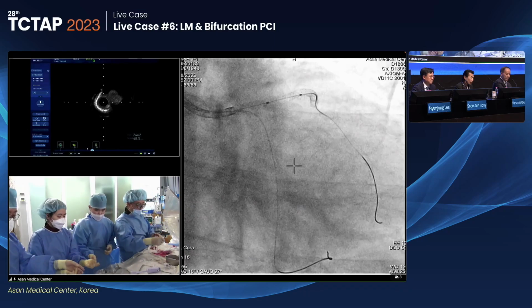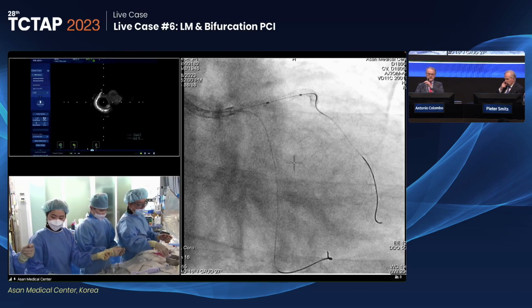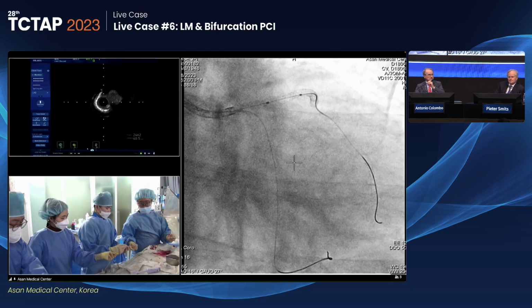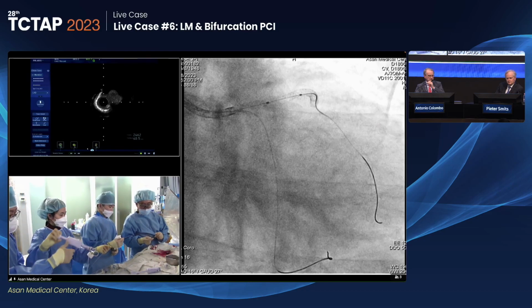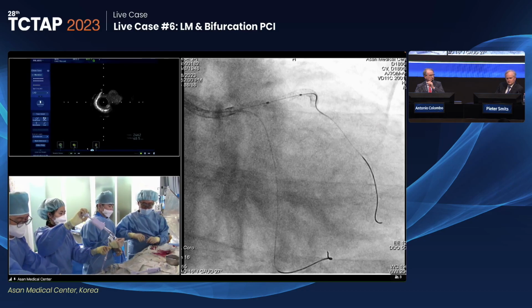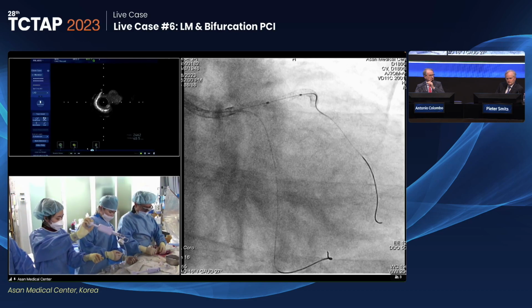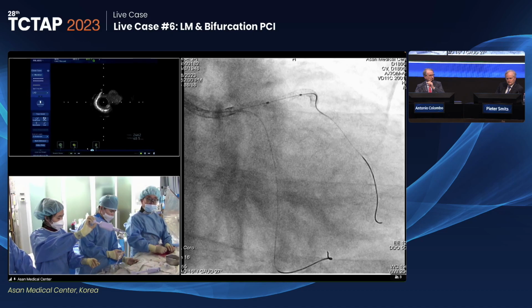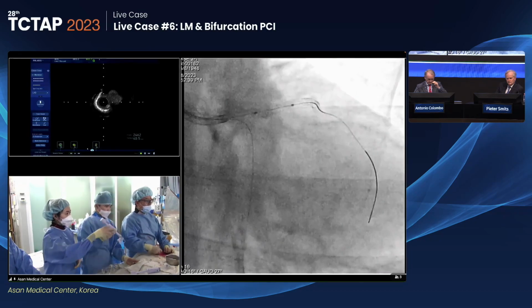Yeah, absolutely. Yes. So on the basis of just checking angiography, many physicians select 3.0, and then IVUS evaluation. One of the merits is you can use a much larger stent with confidence. On the basis of the IVUS, we confirm the vessel size is at least 3.5.